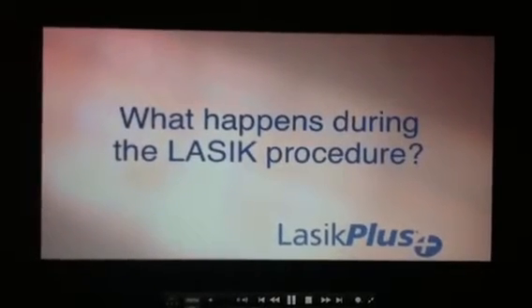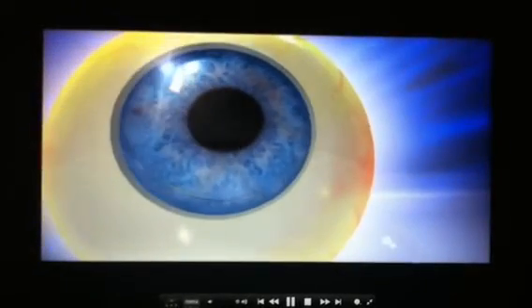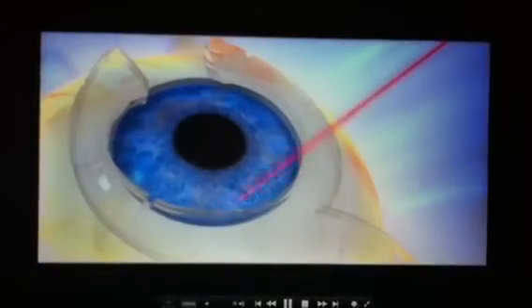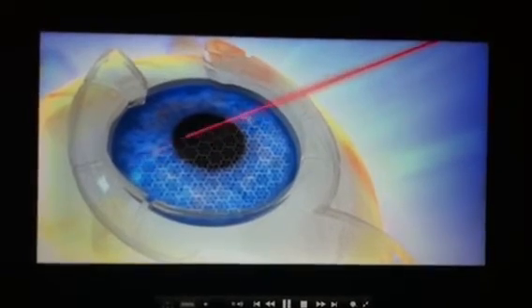What happens during the LASIK procedure? Here's how it works. LASIK is actually a two-step process. In the first step, the surgeon creates a flap of corneal tissue and prepares the eye for making the appropriate correction. If treating nearsightedness, the laser removes tissue from the center of the cornea, making it flatter and reducing the focusing power. This moves the point of focus from in front of the retina to on the retina.